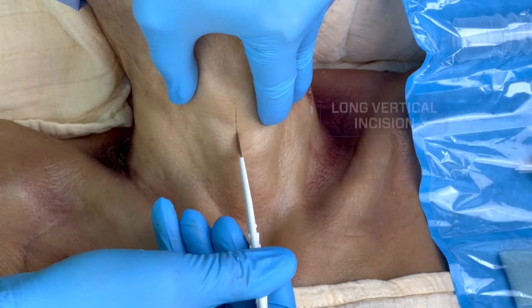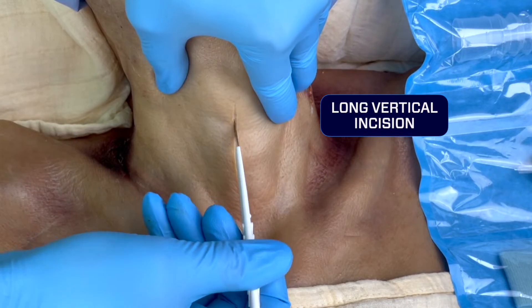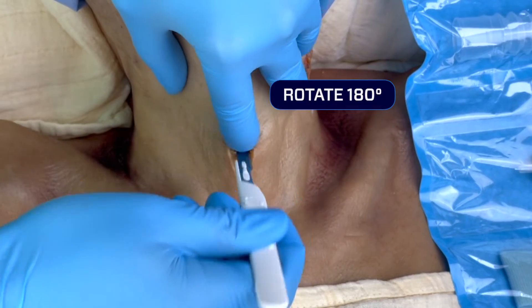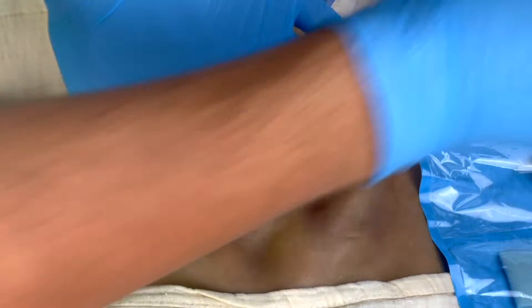Once you've identified those landmarks, go ahead and make a long vertical incision. That will allow you to blunt dissect down to the cricothyroid membrane so you can make that horizontal incision and place your finger in the hole.